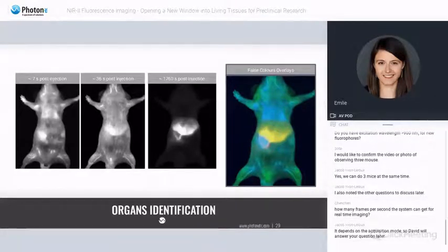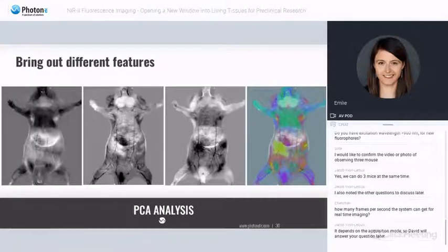So for every pixel of the image, we have the temporal profile. So we can use some algorithm that can analyze all the temporal profiles that we have inside the mouse, and tries to find some patterns, tries to locate some of the temporal profiles which look alike, and categorize them a bit. One such algorithm is called the principal component analysis. So we tried that, and the principal component analysis can output some nice images of similar temporal profile, which show up some nice features in the mouse.